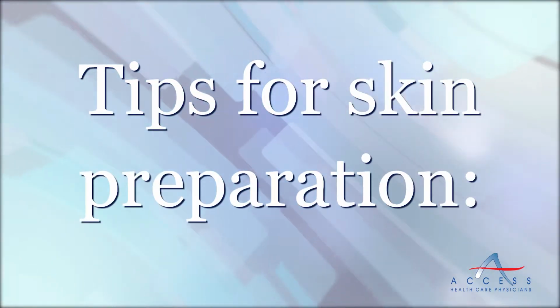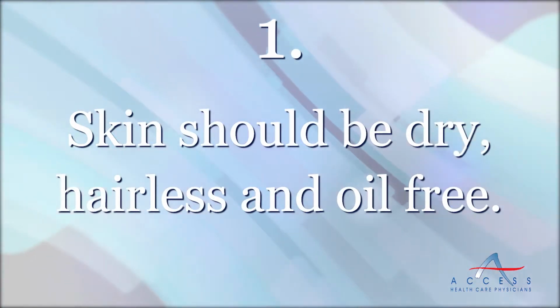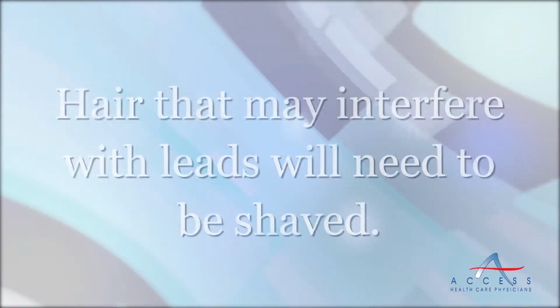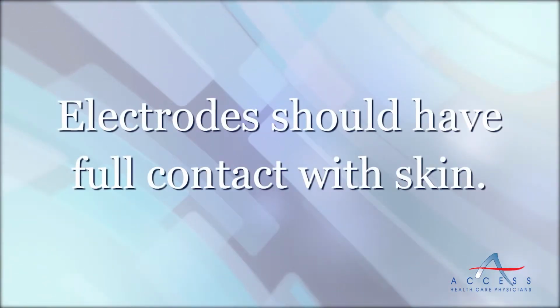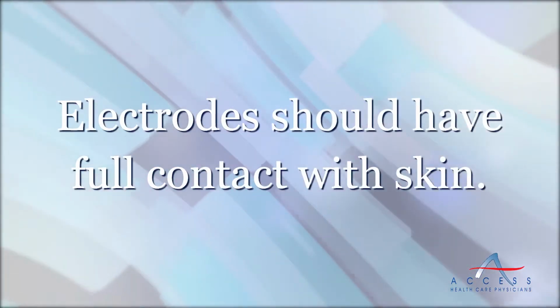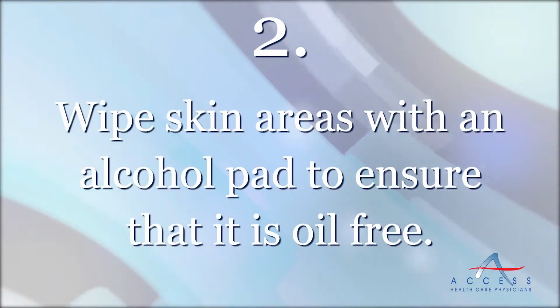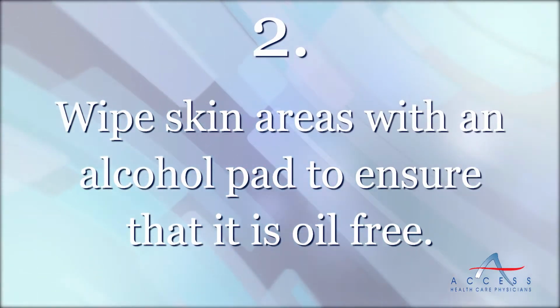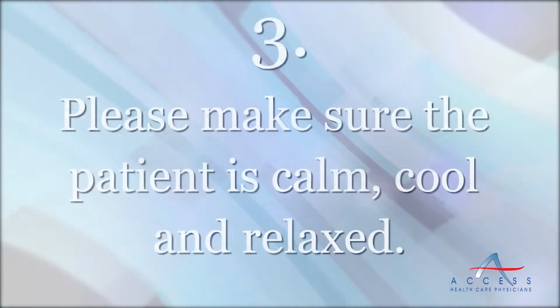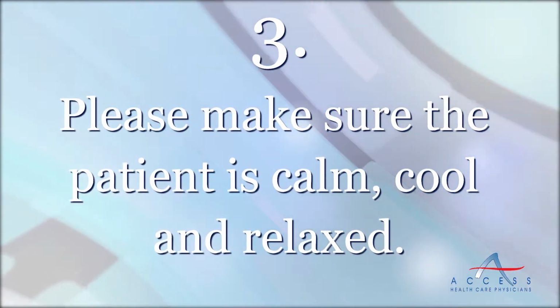Tips for skin preparation. 1. Skin should be dry, hairless, and oil-free. Shave hair that can possibly impede electrode placement. Electrodes should have full contact with the skin. 2. For better electrode adhesion and oil-free skin, rub the area with an alcohol prep pad or gauze pad with benzoin tincture. 3. Promote an environment that prevents the patient from sweating profusely.